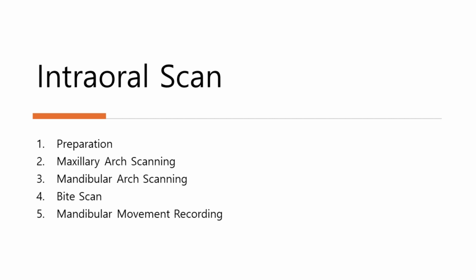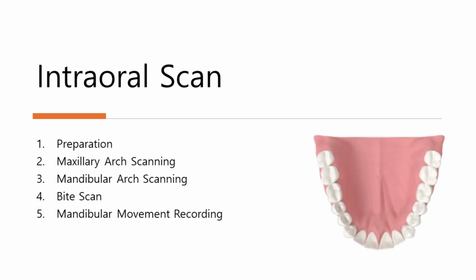1. Preparation. Before scanning, ensure that the patient's oral cavity is clean and dry. Remove any removable appliances and check for saliva or blood. Position the patient comfortably and explain the scanning process to alleviate any concerns.